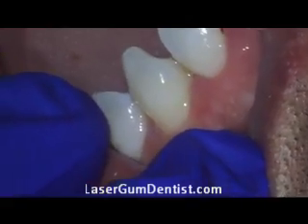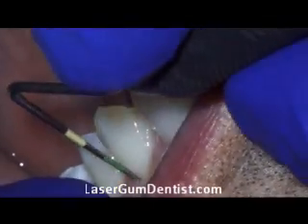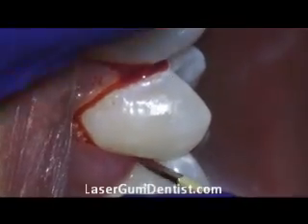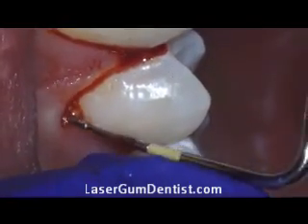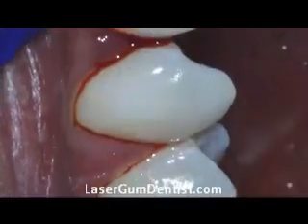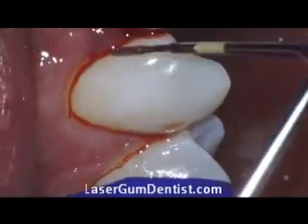The nice thing about this procedure is that no scalpels are used. Since no scalpels are used, you don't have to suture or sew the gum back together. Other advantages are that it's mild discomfort for the patient. I've done over a thousand of these cases and I've never had to give a patient anything stronger than Motrin — no strong narcotics. Most patients say they took some Motrin the first day and never had to take anything after.